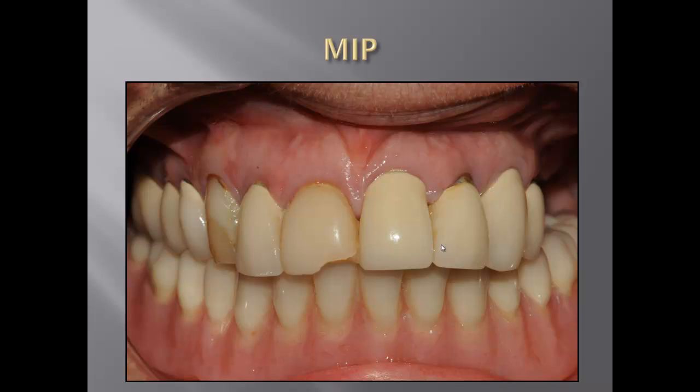So for us to achieve a stable bite and a nice result, and so the patient will not crack the front teeth on her permanent crowns, we have three reference points from the occlusal course. They are P1, P2, and P3, where P1 is the reference point from the joint, what we call CR. Second is P2, it's the MIP, maximum intercuspal position, and P3 is anterior guidance. So we know that she doesn't have P2 and P3, so the only reference point we have is P1.